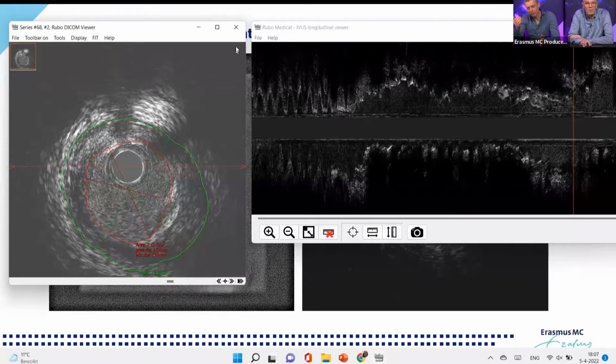Another thing, perhaps a bit more advanced, that you could consider is looking at the type of the plaque. If it's a smooth fibrotic plaque, obviously the likelihood of problems in the future would be different as compared to a plaque with a lot of fat and a thin cap, which also with a trained IVUS you would be able to address. Well, the thin cap with 60 megahertz, you can address them, because the resolution is approximately 40 microns, and what we see is that below 60 microns, the cap thickness, we can consider as thin caps. However, it's always a bit tricky doing this with IVUS, and I doubt if you will do that during your procedure in the lab.